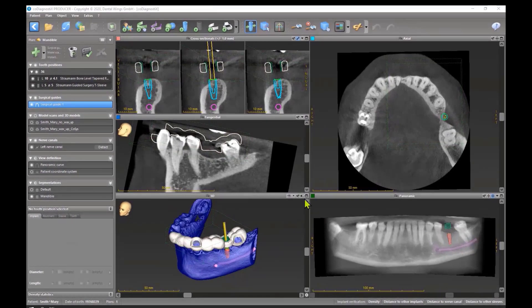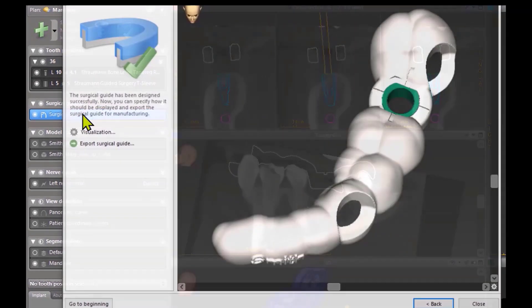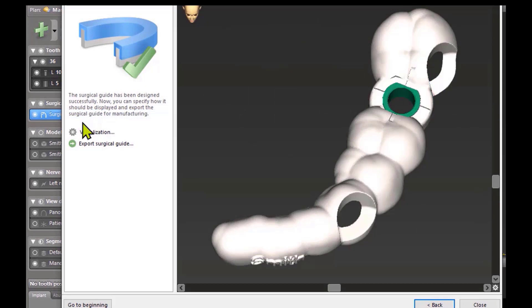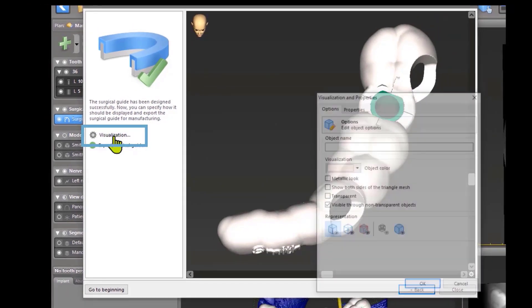This topic is not necessary for planning, but if you want to know a little bit more about your surgical guide, you can double click on it and you see the visualization button. If you click on it you see some buttons.